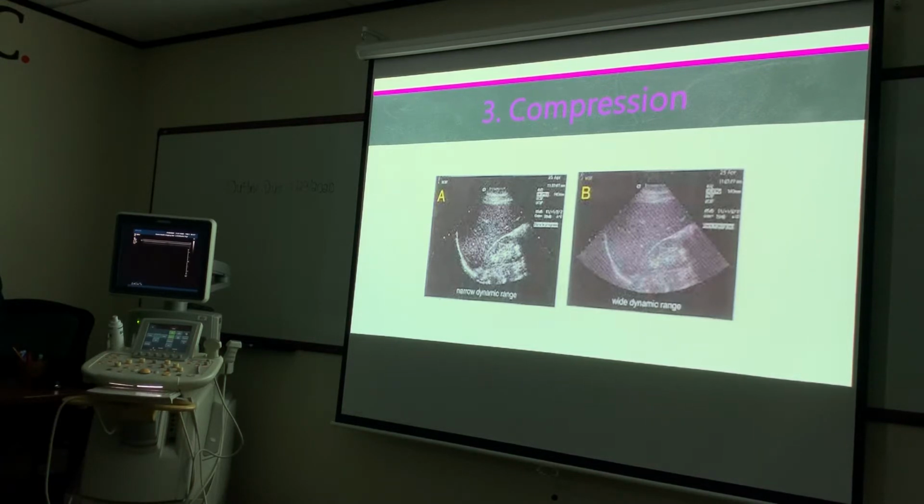Not like a Hounsfield unit, because that's based on the matter, right? The Hounsfield unit is based on how X-ray photons display. This isn't like that, because we can change this. You know, it's going to change.